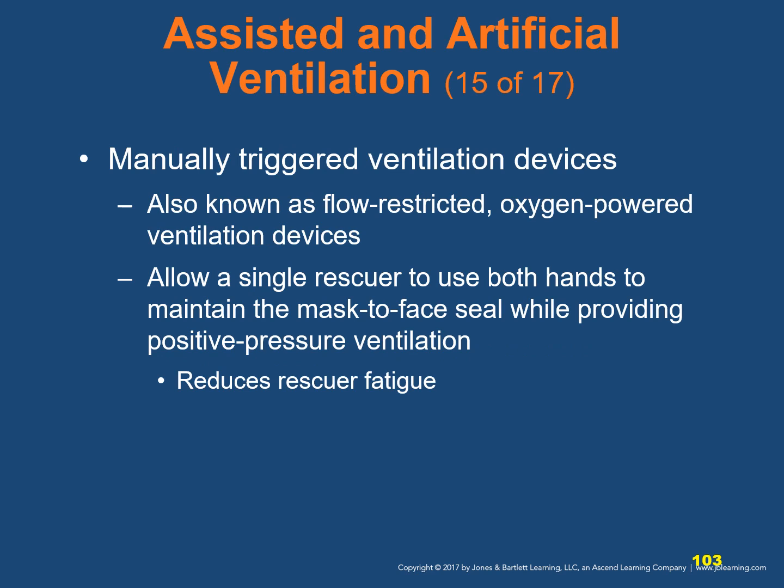There are manually triggered ventilation devices. These are also known as flow-restricted, oxygen-powered ventilation devices. They allow a single rescuer to use both hands to maintain a mask-to-face seal while providing positive pressure ventilation. This reduces rescuer fatigue associated with using a BVM on extended transports.